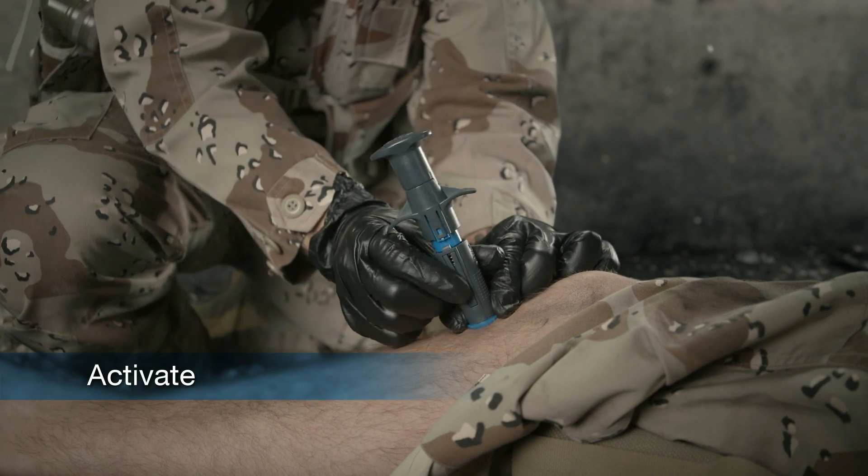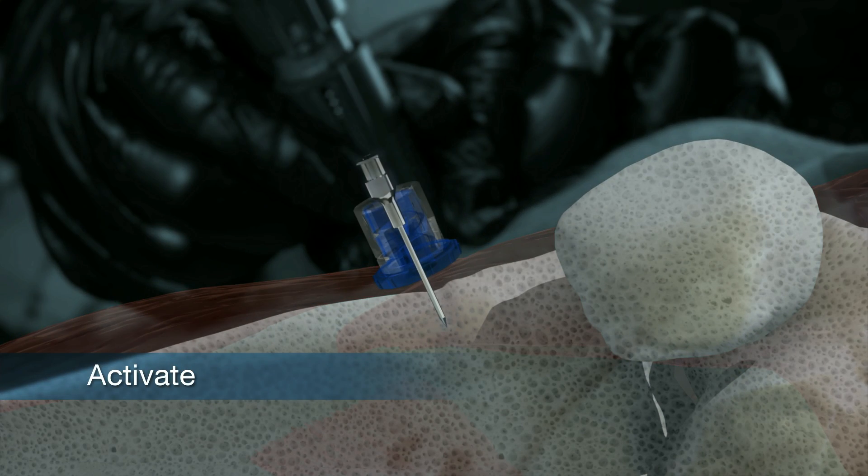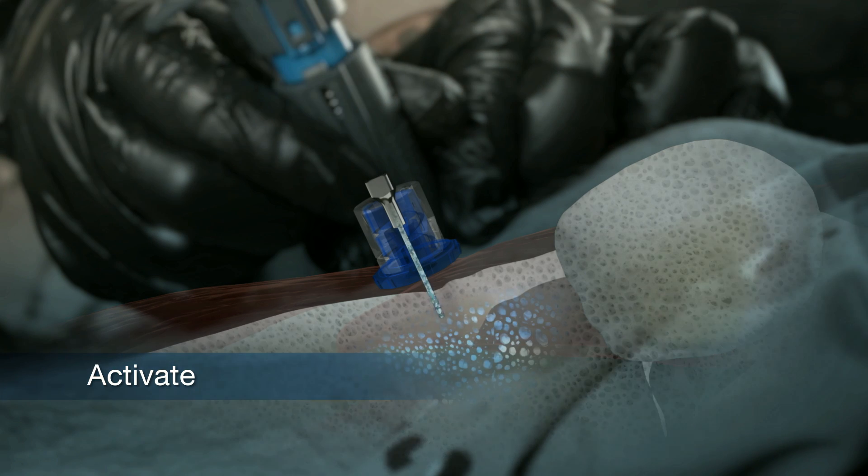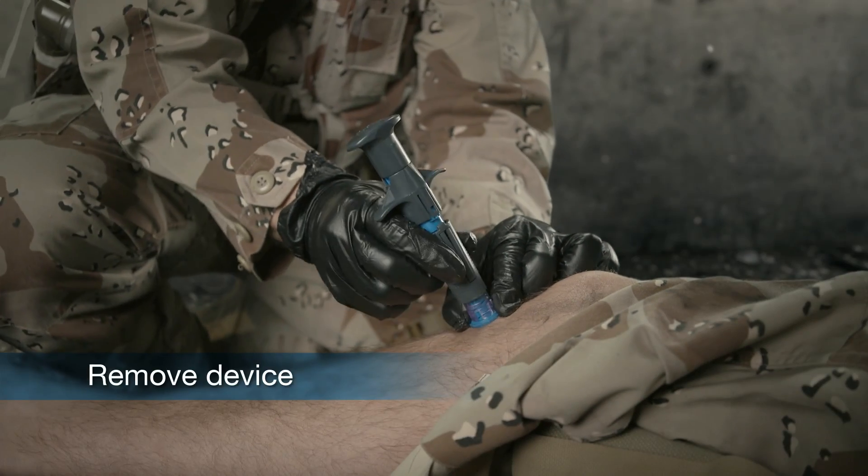The needle should be deployed through the thinnest portion of the cortex in an area that has high vascular content. Remove device.